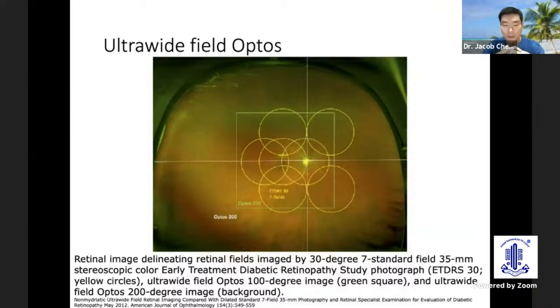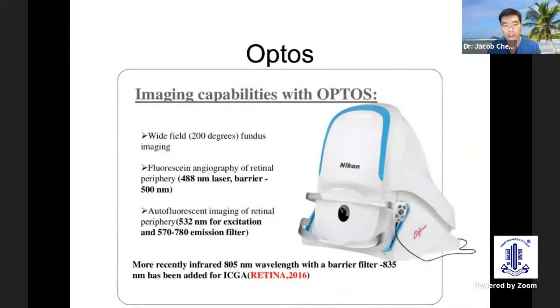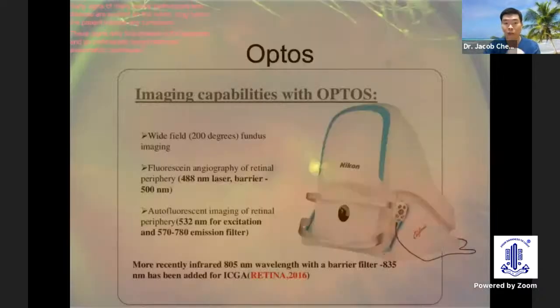This is a picture from the ETDRS study where we can see the seven circles indicating the seven subfields, as well as the early Optos 100 in the square with limitations of the retinal field, but now with the Optos 200 degrees, we can have a wider field. And here the imaging capabilities of the Optos would be that of the 200, as the earlier speaker has mentioned, as well as incorporated in it will be the fluorescein, autofluorescence, as well as the ICG in the California system.